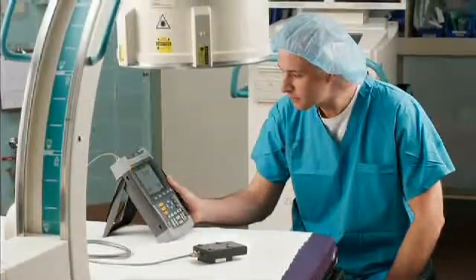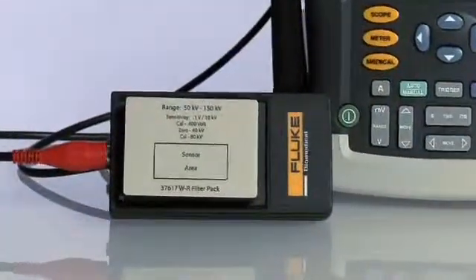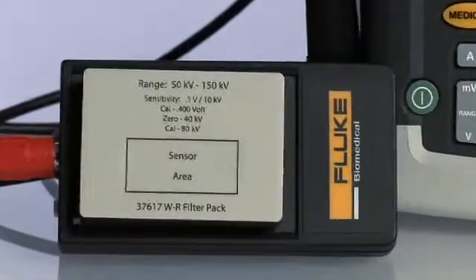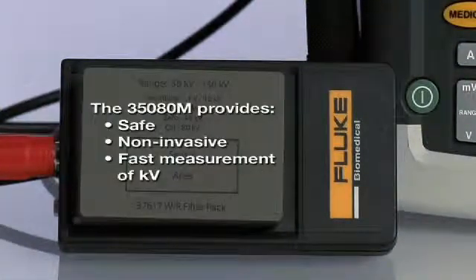The Model 35080M-KV Divider is a versatile alternative to a heavy, high-voltage divider tank. It provides a safe, non-invasive, fast measurement of KV without endangering personnel or equipment.